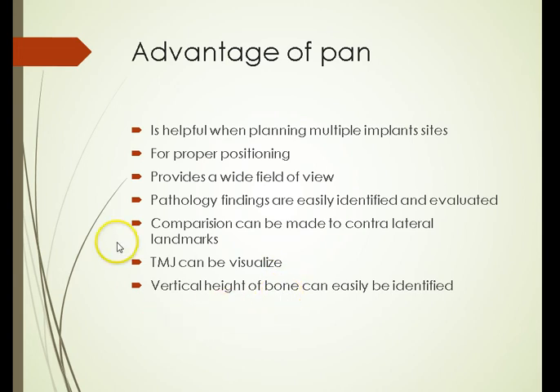And using the distortion technique we talked about, it can be a good predictor of the vertical height. The width, obviously, you can't, not width, the depth, I'm sorry, from palatal to buccal or lingual to buccal, it's tough, or not just tough, it's impossible, but the vertical height can be predicted using that technique we talked about.